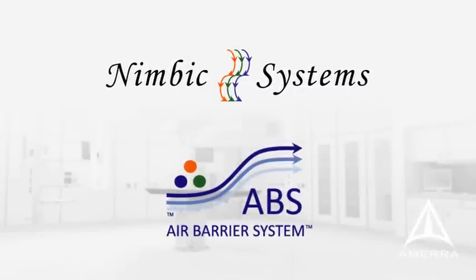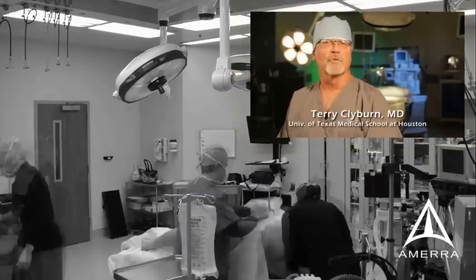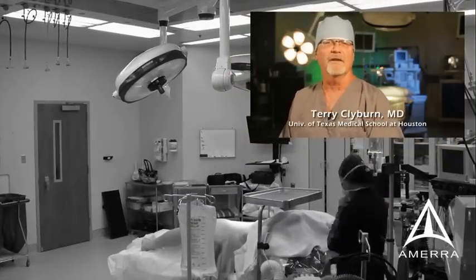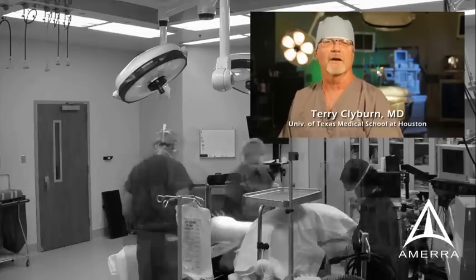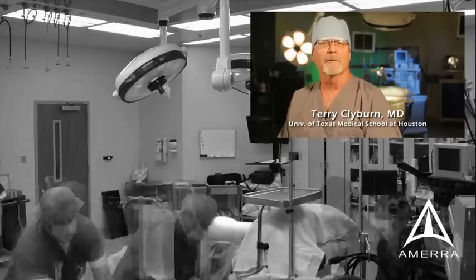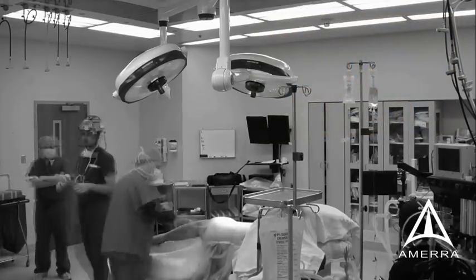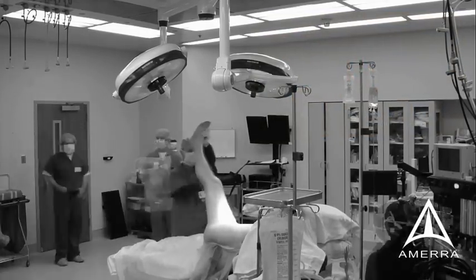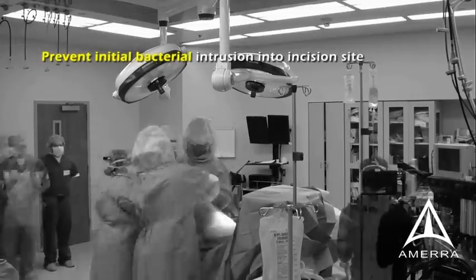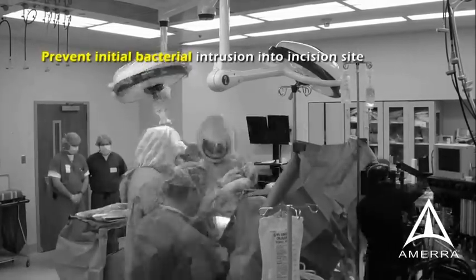Air barrier system. We know that the majority of prosthesis implant infections are colonized by skin bacteria such as staphylococci that protect themselves in biofilms and are becoming more resistant to antibiotic treatment. These bacteria are likely seeded into the incision site at the time of surgery. Anything that can be done to prevent the initial intrusion of these organisms is highly desirable.